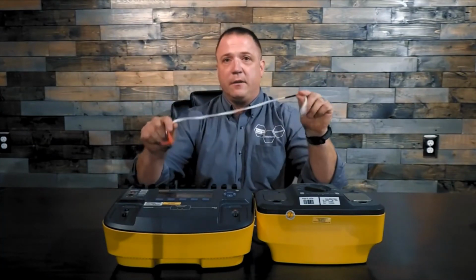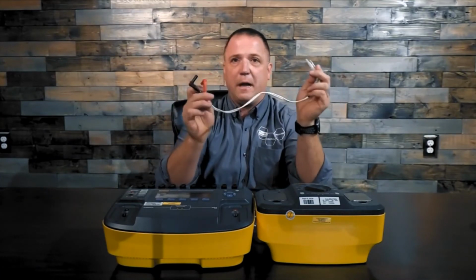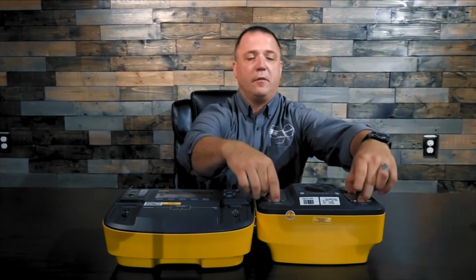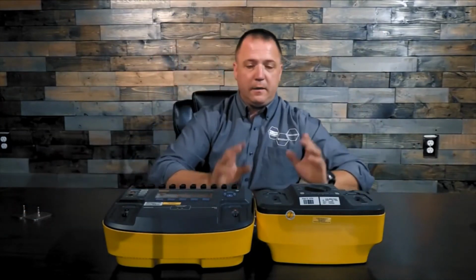All right, the other thing that you're going to need is a set of hands-free adapters. Most defibs anymore, we're no longer using paddles, so it's much safer to use the hands-free adapters, in which case then the stainless steel plates that come on the 7010 load box can now be removed. There we go.